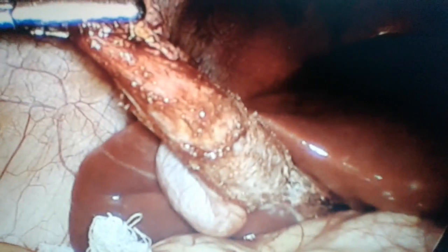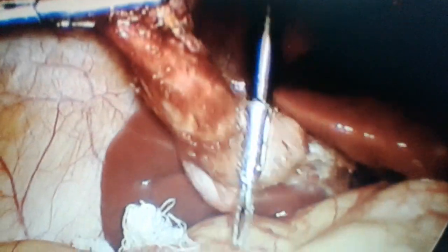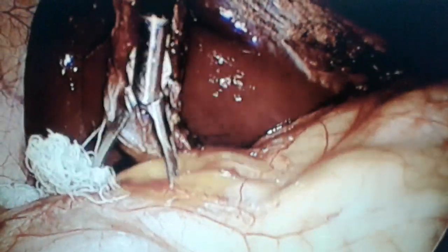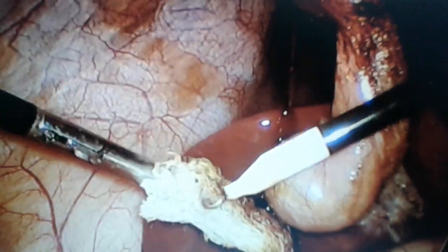Another important intraoperative minor complication that may arise is this: again, the loose holding of the gallbladder by the assistant. Now again, a problem in operating, a difficult procedure, but anyway, it's a team and we will have to support each other.